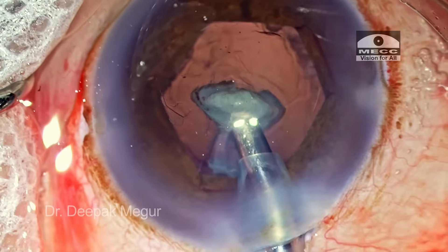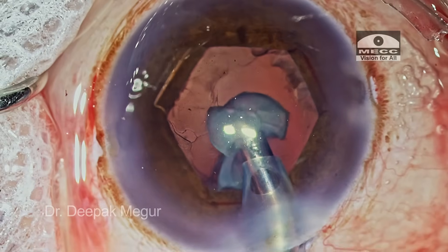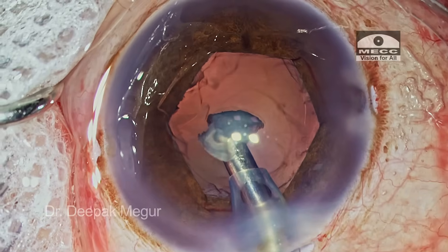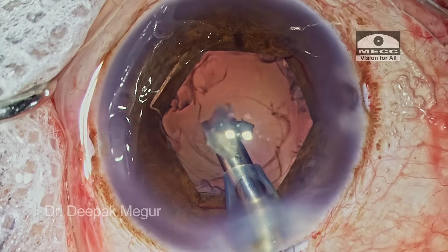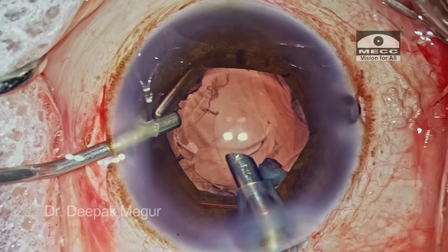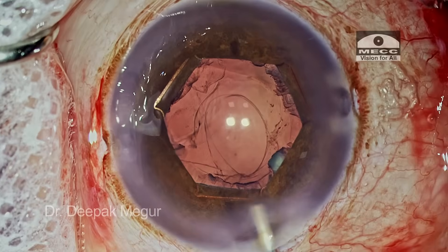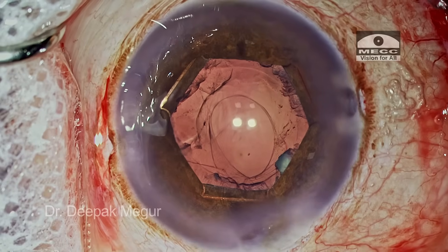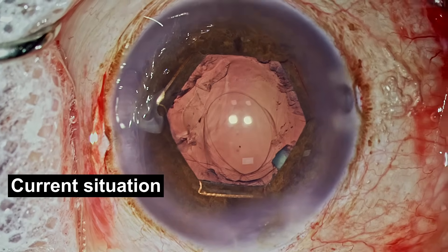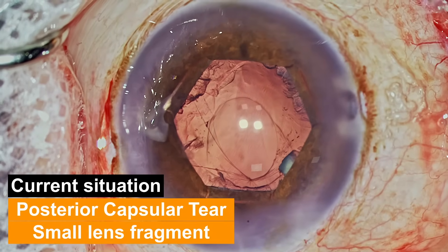In the previous episode, we saw that the posterior capsule tear happened during the aspiration of the last fragment because there was intense positive pressure and the posterior capsule was very close to the phaco probe. We have a nice circular opening. The surgeon very wisely introduced OVD before getting the probe out. We have a PC tear and a small lens fragment still inside.